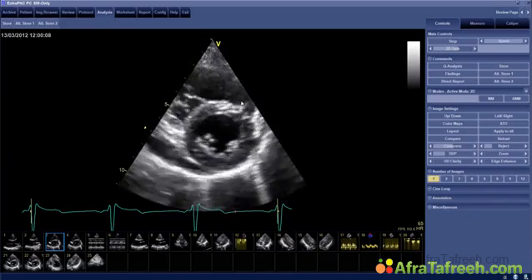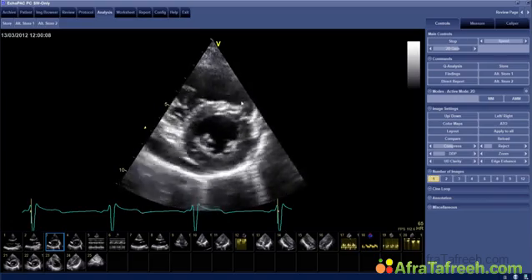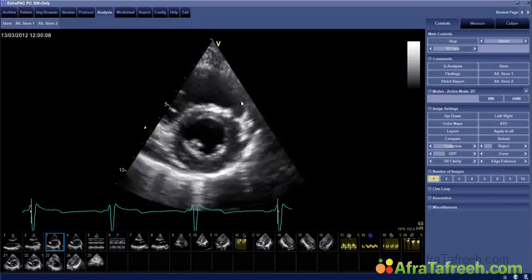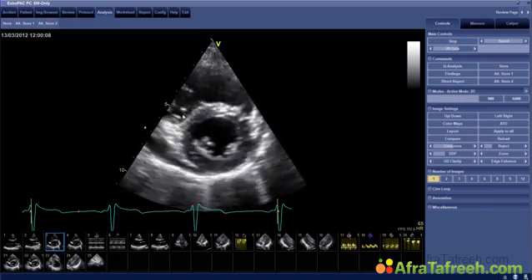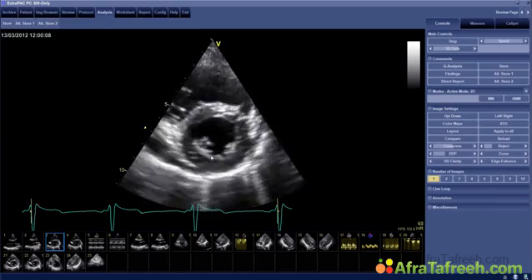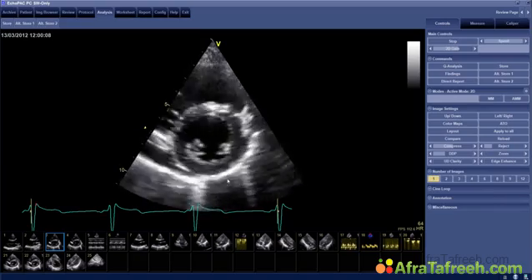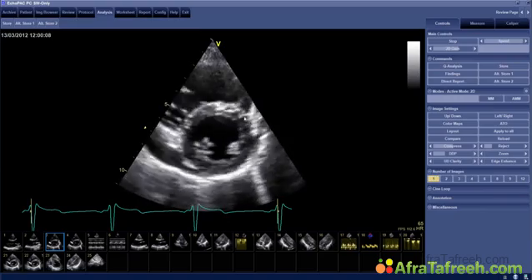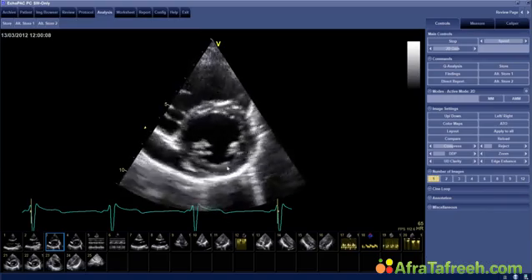So I take this under consideration. For me, if I look at this ventricle, I would probably say it's moderately reduced, but then I consider that there's also abnormal motion, so I say maybe, okay, it's mild to moderate. And then one other thing that is certainly true, Emmanuel made this comment, you have a hyperdynamic compensatory motion of the posterolateral wall, which is sometimes something you see very frequently in patients who have a myocardial infarction, where you have an inferior infarct, for example, and the anterior wall seems to compensate for it. So this must also be considered.